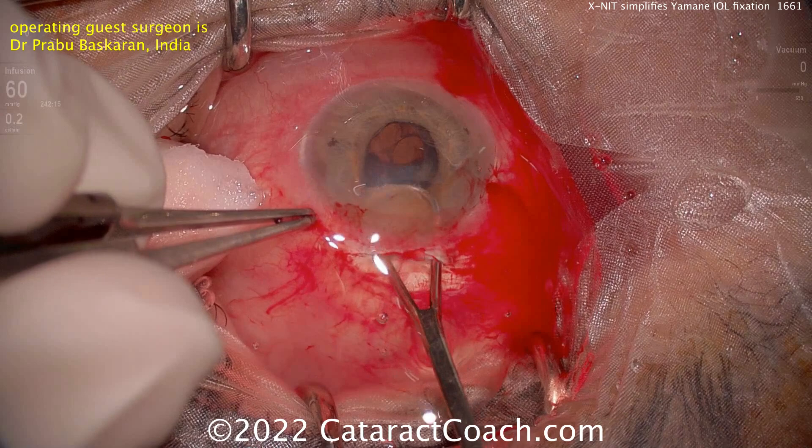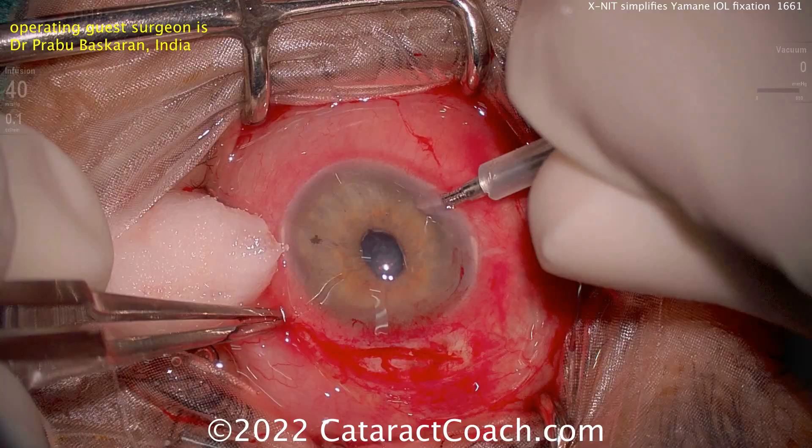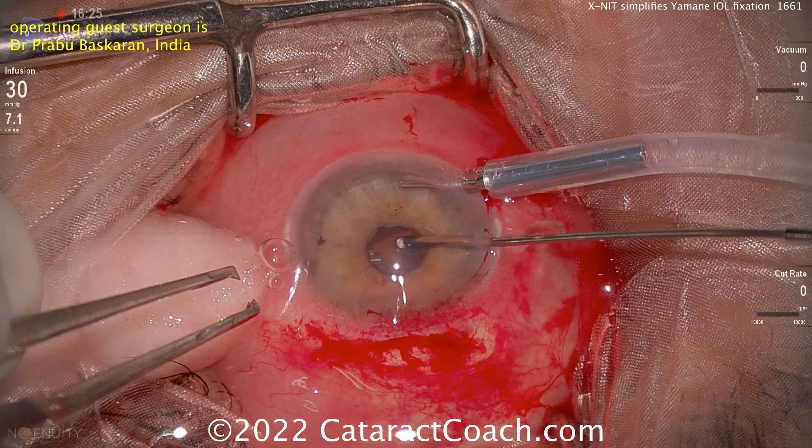This patient has a dense cataract coming out using an SICS technique, and really has no capsular support. Whatever little capsule or bag is there is going to be taken out. Here's an infusion port going inside the AC, and you're going to have to do a little bit of an anterior vitrectomy — cleaning that up. The whole capsule and bag came out. There's just a dense cataract with no capsular support.